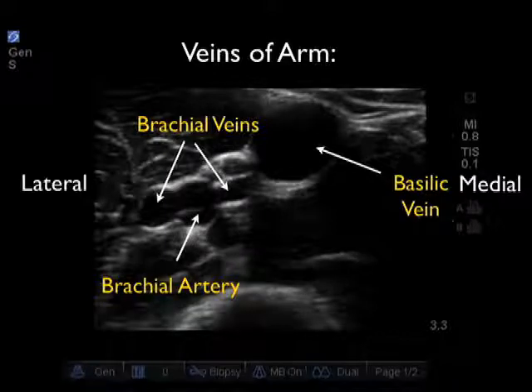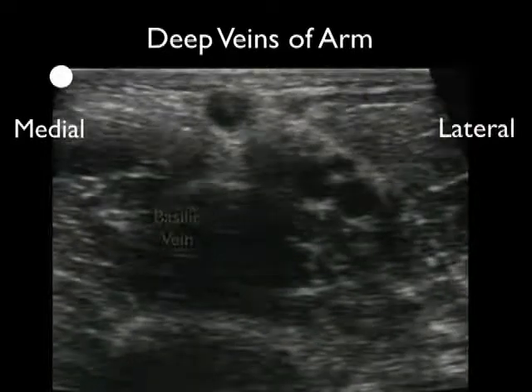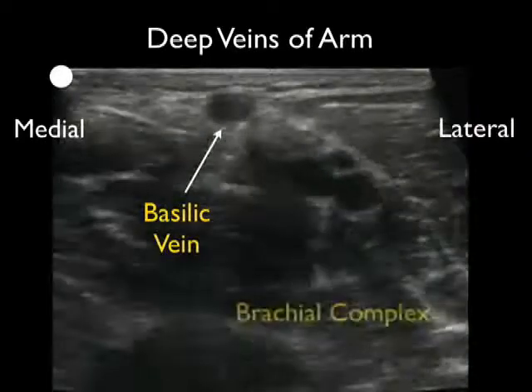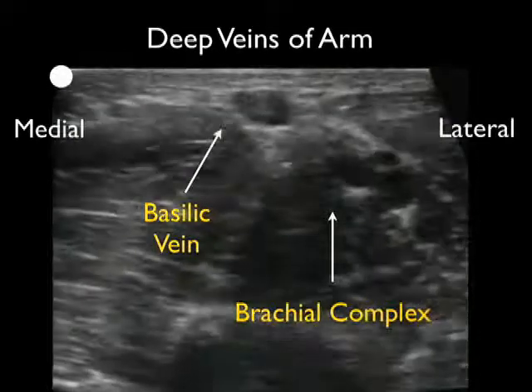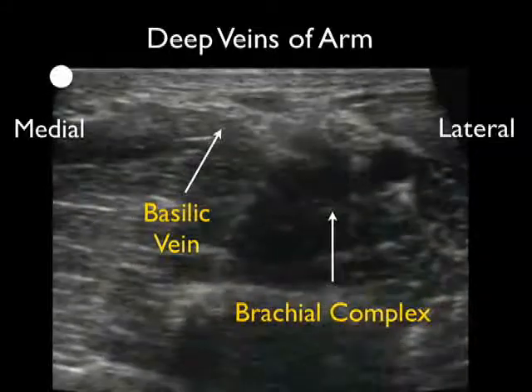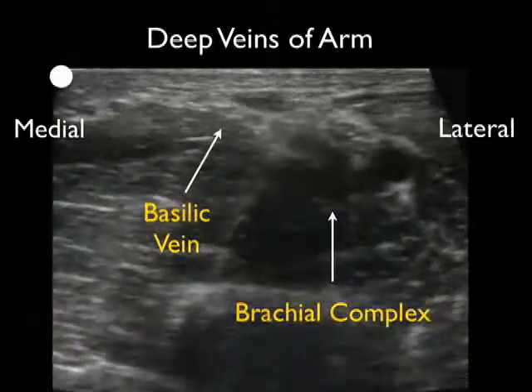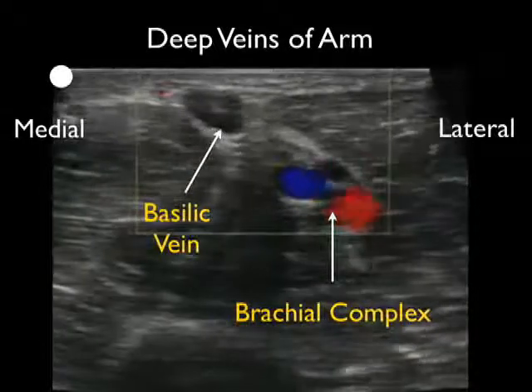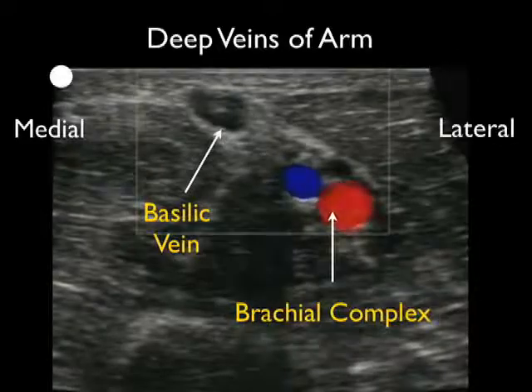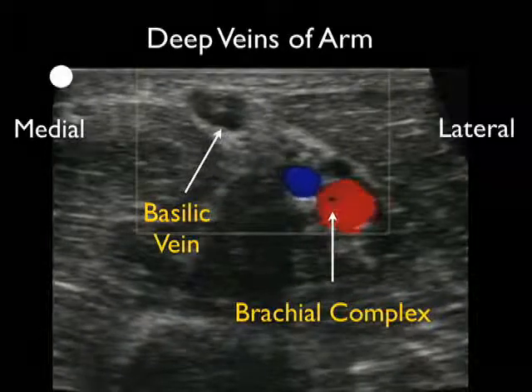In this patient, the basilic vein would be the preferred target for placement of a deep arm IV. Here's a different patient — again looking at the relation of the basilic vein to the brachial complex, medial is to the left and lateral is to the right. We see the superficial basilic vein and the deeper brachial complex. Applying pressure shows that all venous structures — the basilic vein and the deep brachial veins — compress completely, helping us differentiate venous from arterial structures. Applying Doppler flow again differentiates the brachial artery by its pulsations consistent with arterial flow, with a lack of significant flow within the venous structures, specifically the basilic vein.